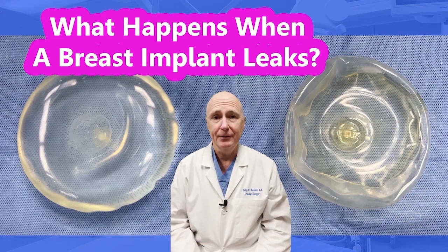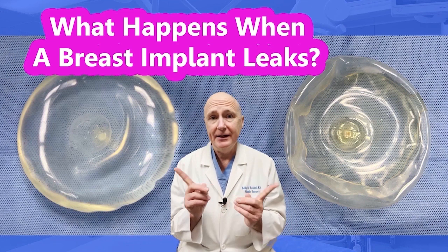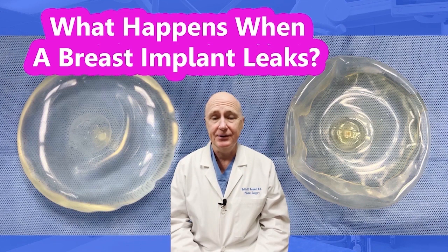I'm Kelly Kunkel, a plastic surgeon in Fort Worth, Texas. These are actual implants I removed from a patient during surgery. Let's talk about what happens when breast implants leak.